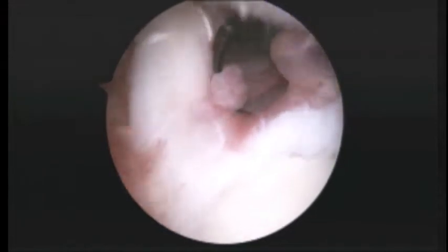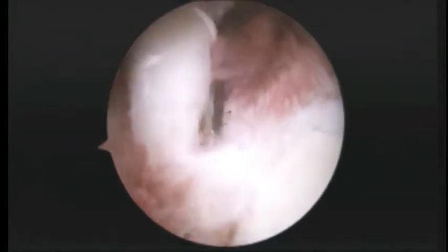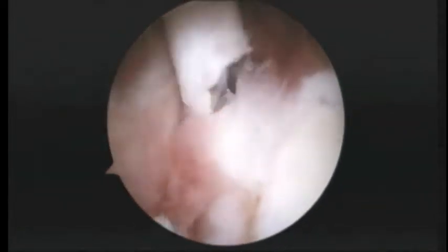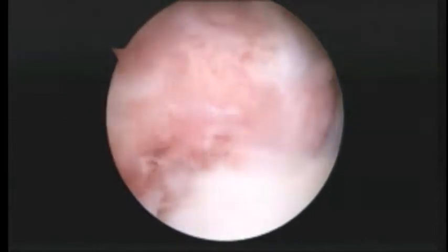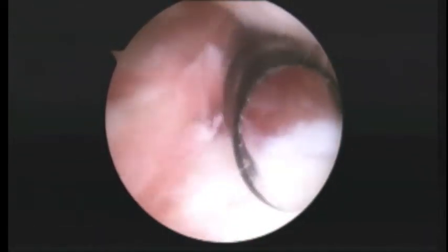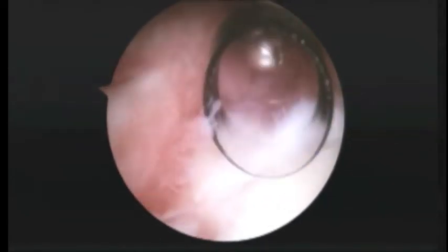So now we're going to go ahead and take a pair of scissors and cut the biceps at its base, right down here. And now we'll put in our shaver and try and clean up some of the areas in the joint that may have some arthritis, and we'll also get a look at the rotator cuff. How's our friend doing? Pause please for a second.